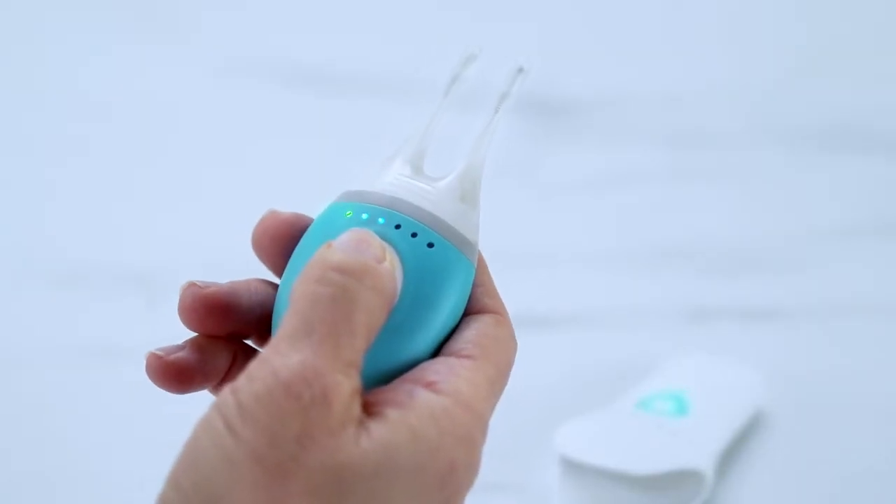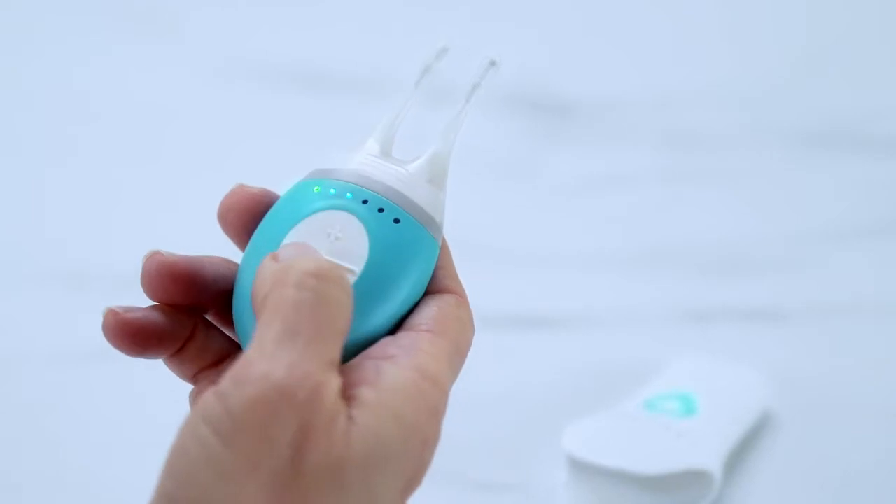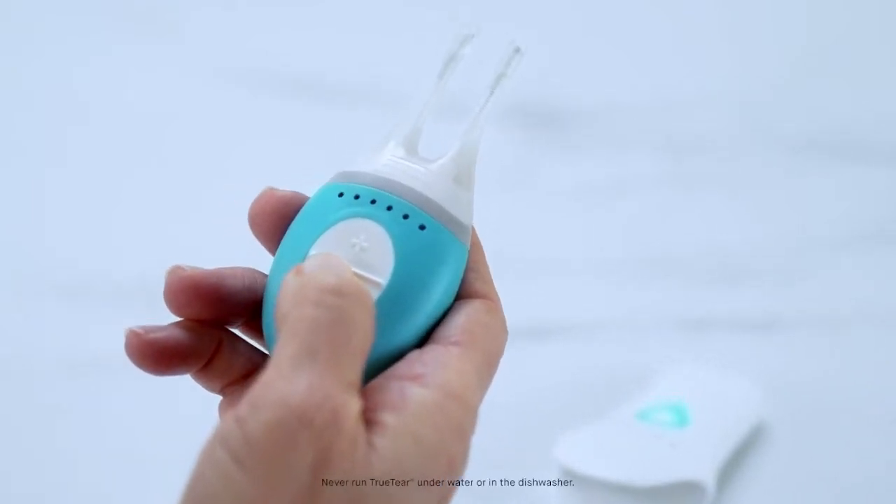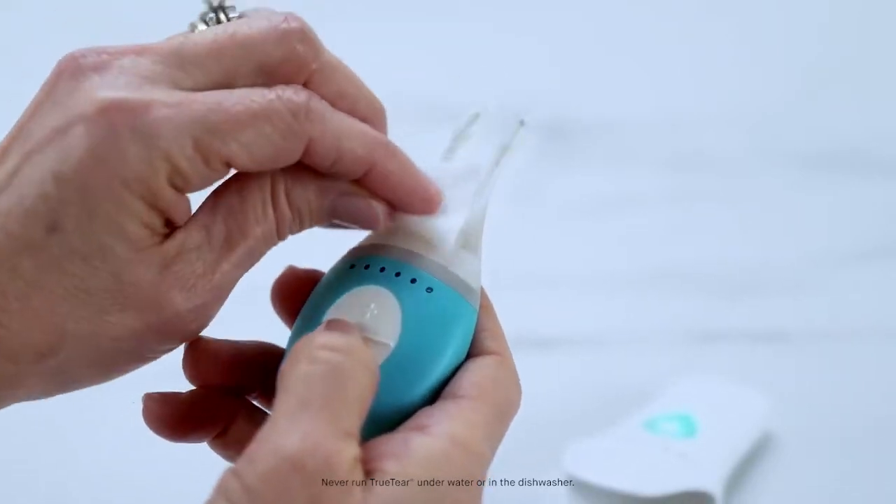TrueTear will automatically turn off after one minute, or you can turn it off by holding down the minus button for two seconds. Be sure to clean your device and tip after each use with an alcohol wipe. Do not allow others to use your device. Cover the tip when not in use.